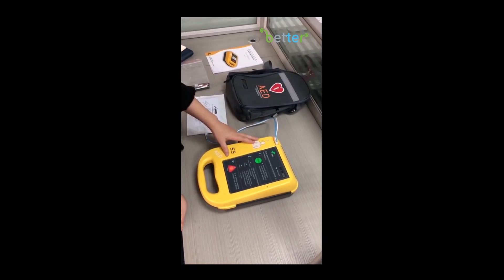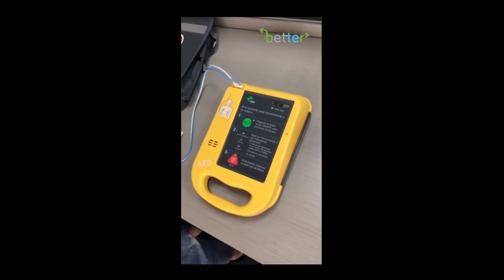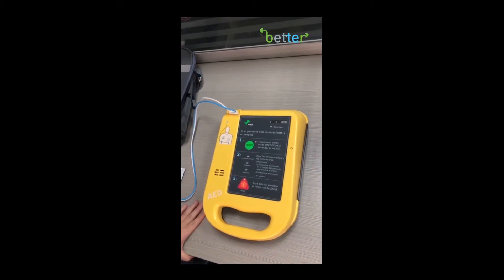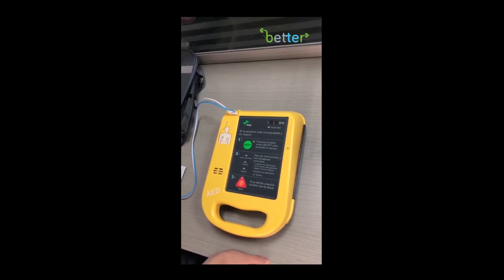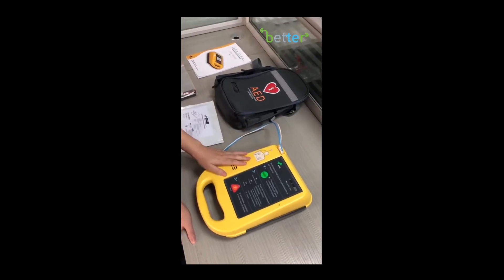Today I'm showing you the Spanish version. Besides this, we still have the English version, Russian version, French version, Italian version, and so on. Next, you just need to plug in the electrodes and press the button.